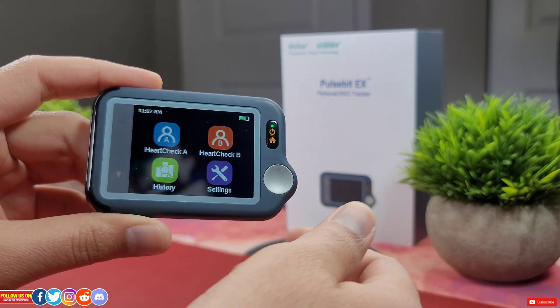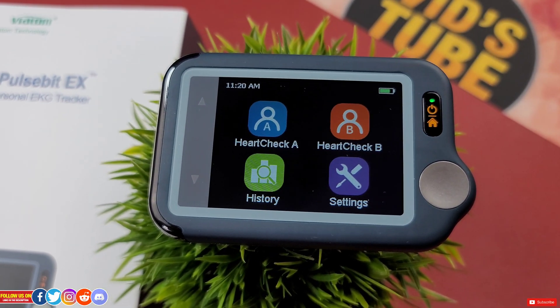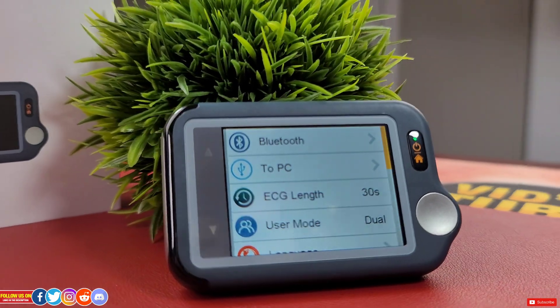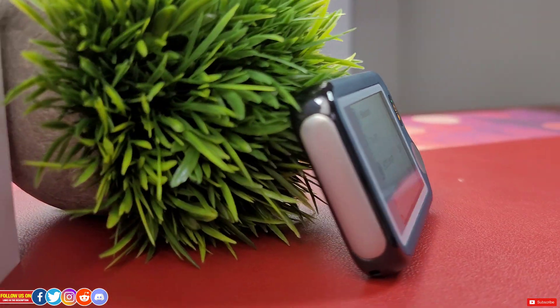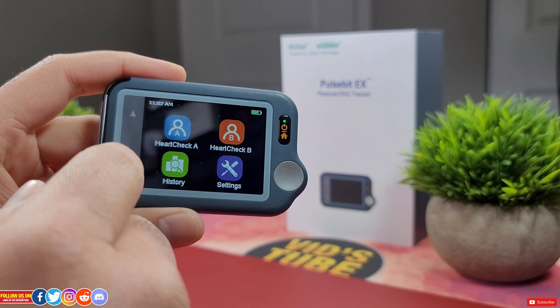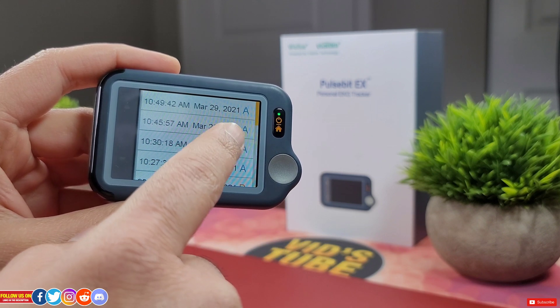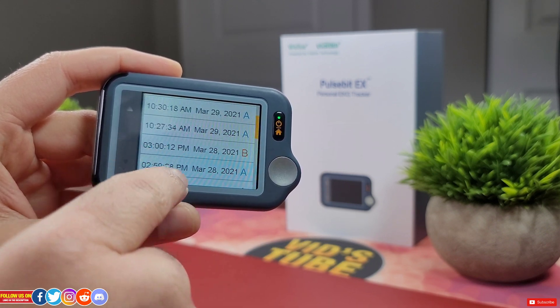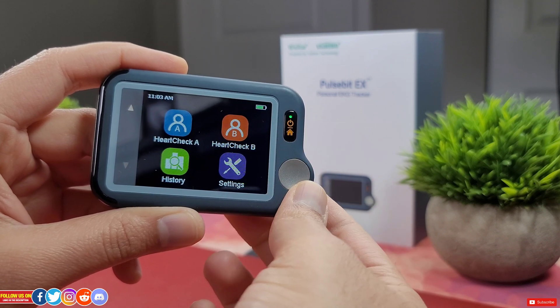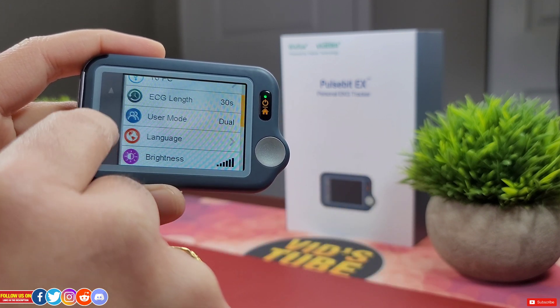Let's talk about the user interface. Vihealth did an exceptional job with a super simple interface — anyone can use it, especially seniors for whom navigating a complex interface can be a learning curve. You just press the button to turn the device on or off. The main menu has health check for User A and User B, a dual-user option that's ingenious for tracking readings for two individuals, and a history section where all readings are labeled with date, time, and user. Last item is Settings.